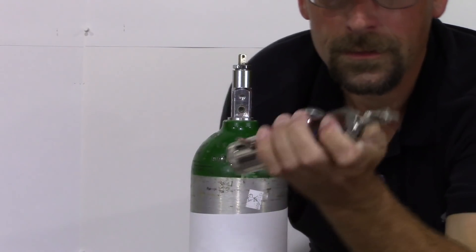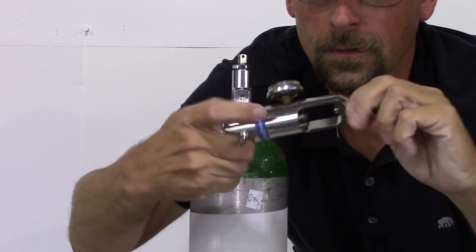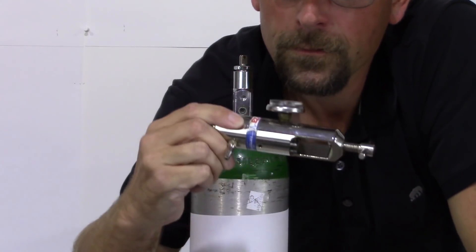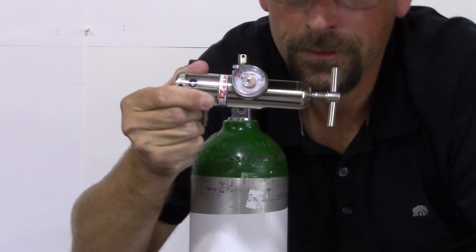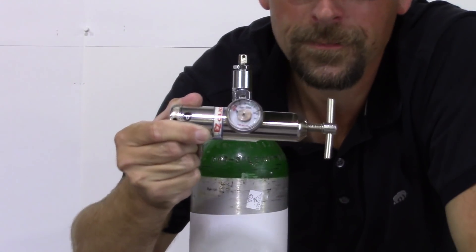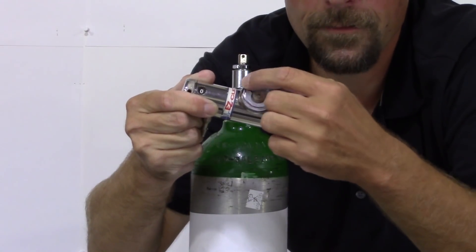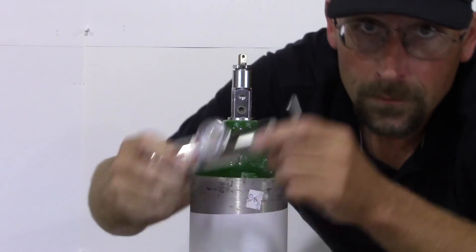Here's our standard regulator. Gauge on here goes from empty to full. Your tanks are pressured at about 2,000 PSI. You'll see it goes from the green into the red when it's empty.